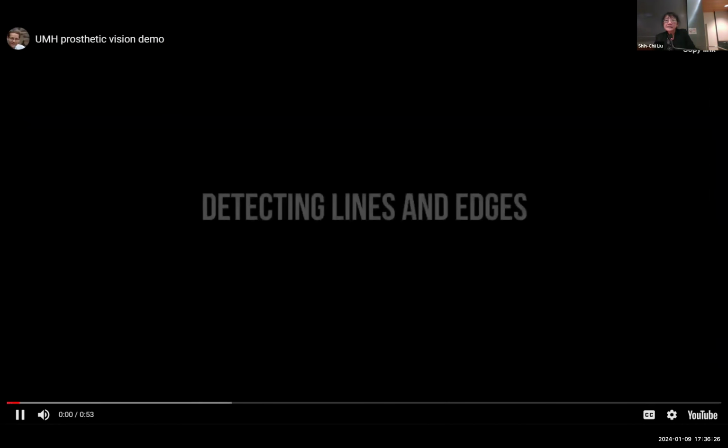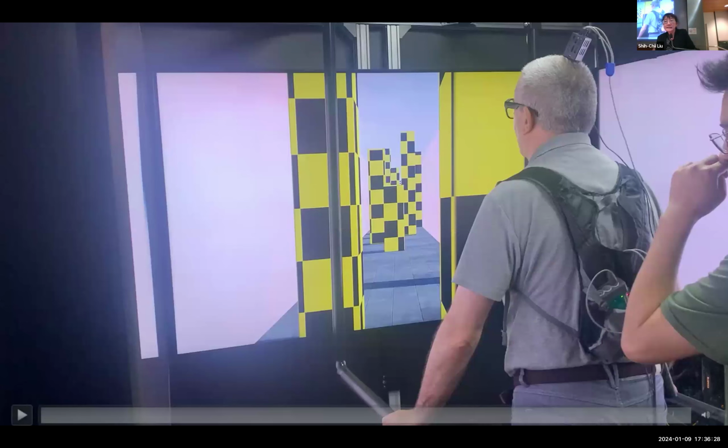And the next one that I'm showing is the second patient that they had. You can see how it sits on top of the skull. In this case, the electrodes went into V2 instead of V1. The first one went into V1. The second one, they had to move it to V2 because of the shape of the head. As I understand, when the person slept, the thing would hit. When you sleep, you don't want this thing to smack onto the mattress.